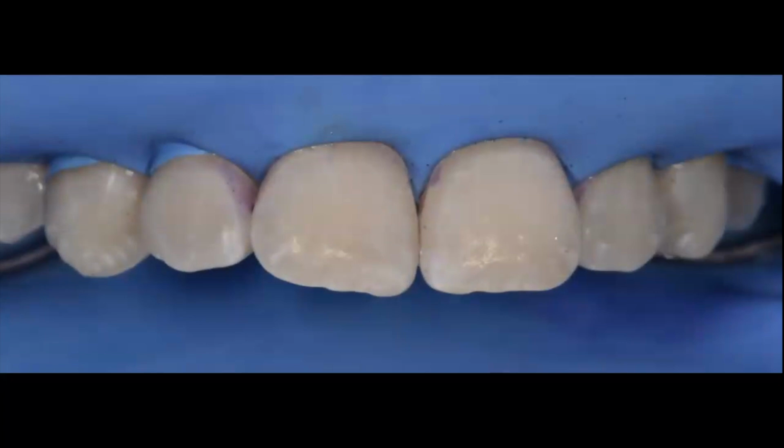And as you can see, after a couple of applications, the white spots are almost gone completely. And I think that for this patient, we did maybe 3 or 4 applications. And again, this is done without anesthetic.